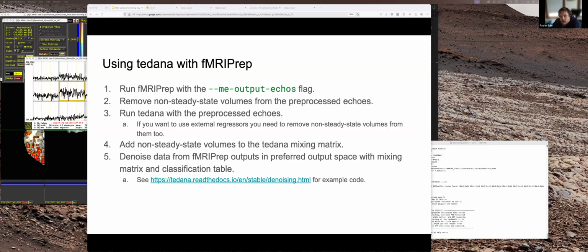All right, the next one was Nelson. In my data set, I have seen that significant physiological noise is present in the final FC maps when I use only tedana components for denoising, but I am unsure if it's correct to use aCompCor and GSR here.